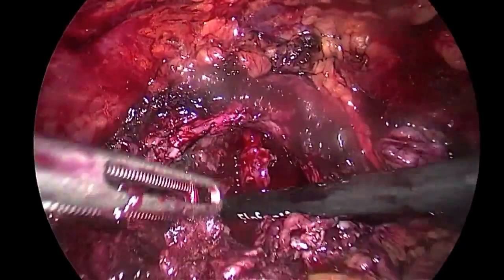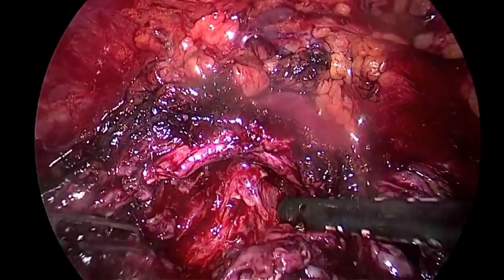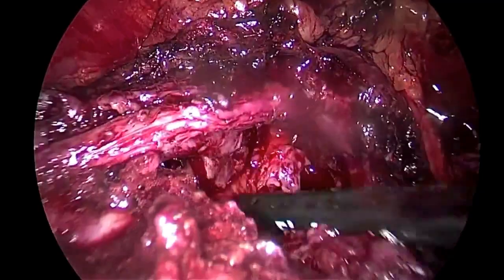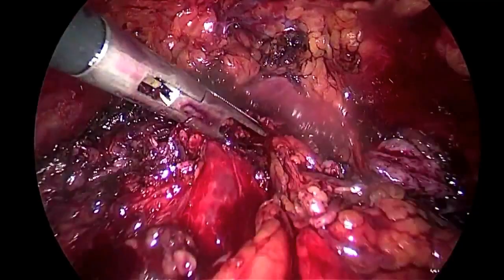Can you give me a flow seal? So as you can see, I performed the trigonization. I think that the hemostasis is good. I can give, if I'd like, a stitch here. Otherwise, I can now perfect the hemostasis thanks to the flow seal inside the loggia. And after I can obviously introduce the catheter, okay? So the trigonization has been completed here, and then I finish with the suture of the capsula in this way.